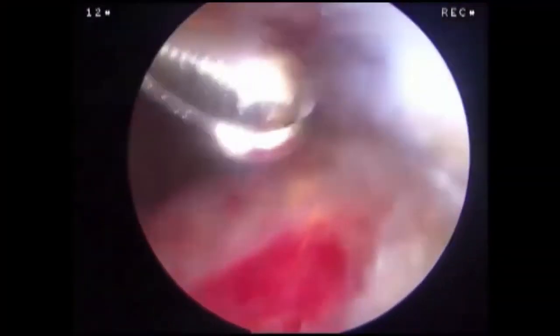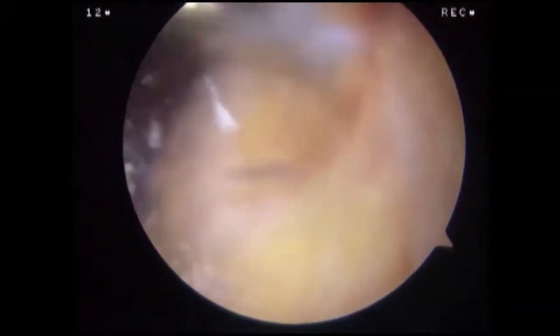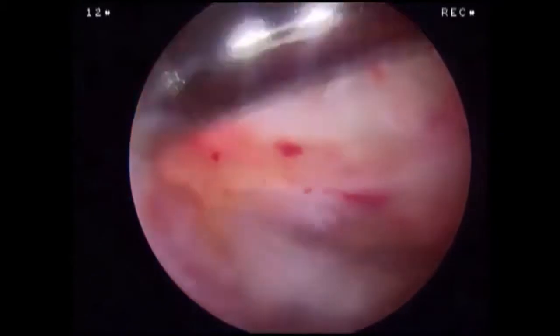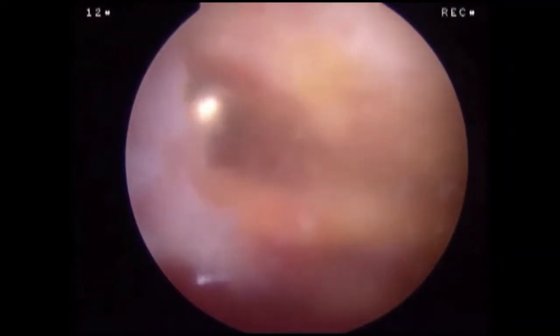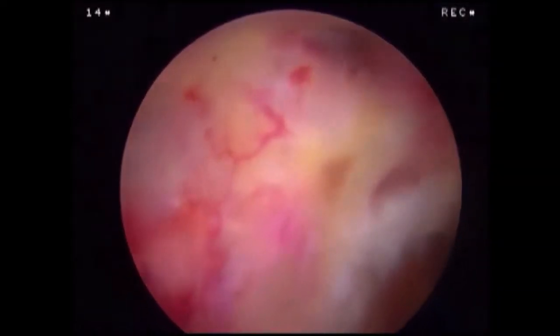The bursa is removed from the anterior subdeltoid space and lateral gutter. If present, a rotator cuff tear is visualized, debrided, and prepared for repair. A motorized shaver or burr can be used to define the borders of the acromion and remove the lateral overhang. Electrocautery can be used to coagulate bleeding vessels and release the CA ligament.